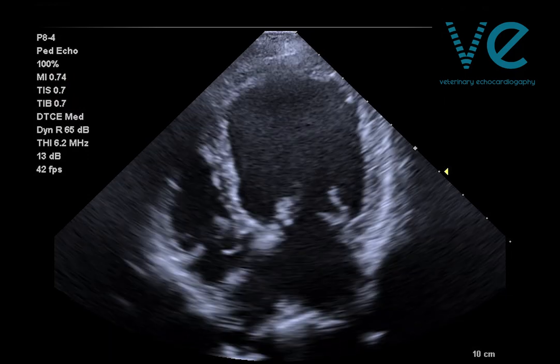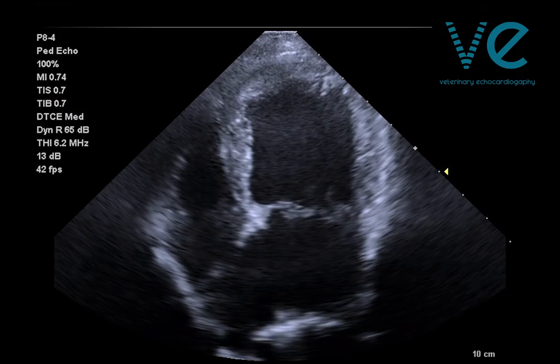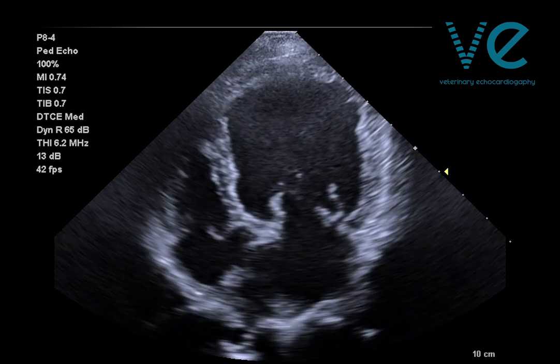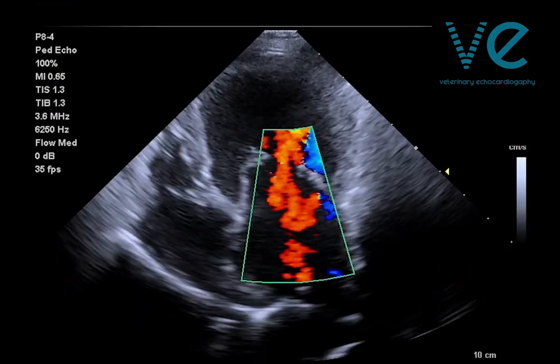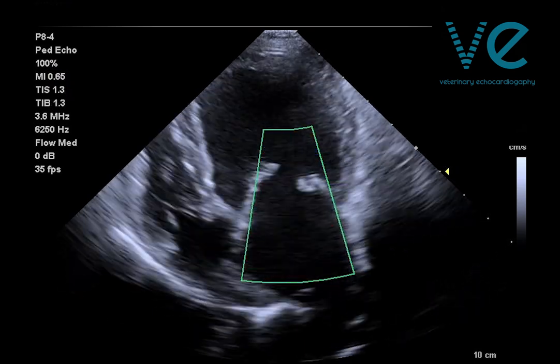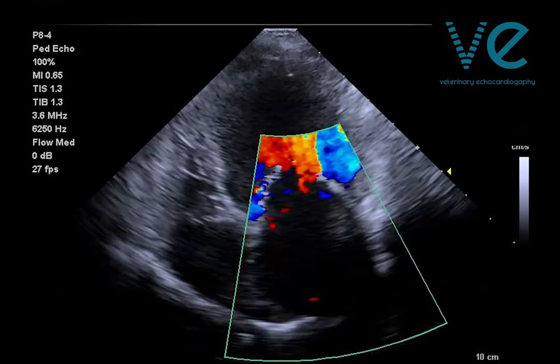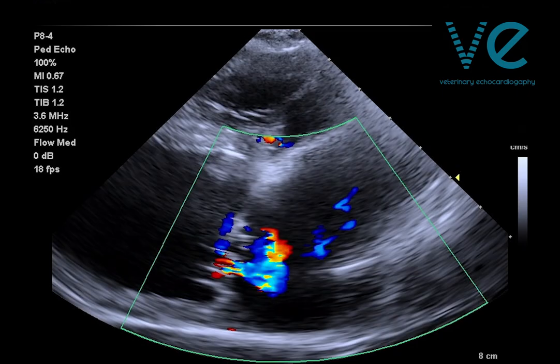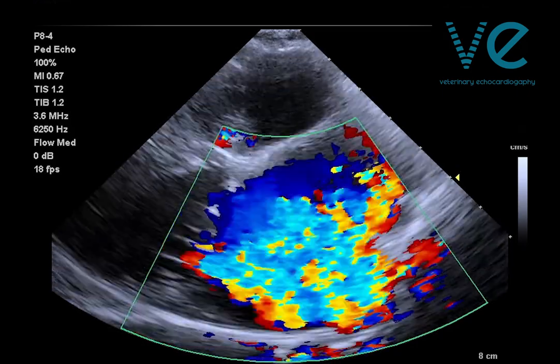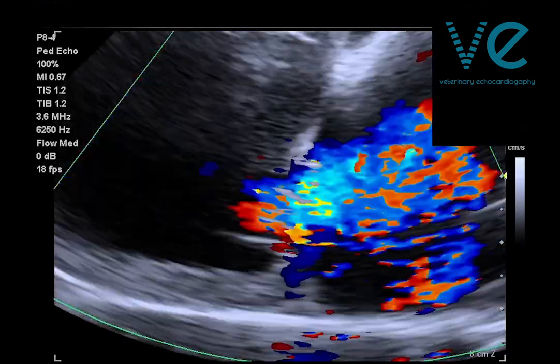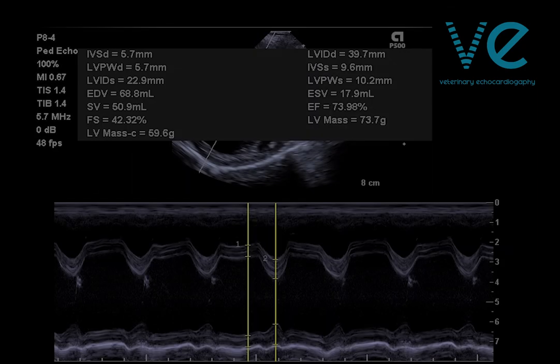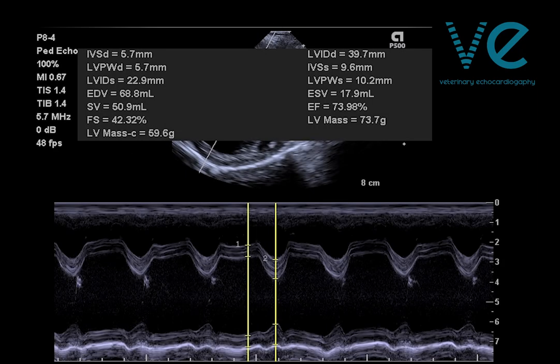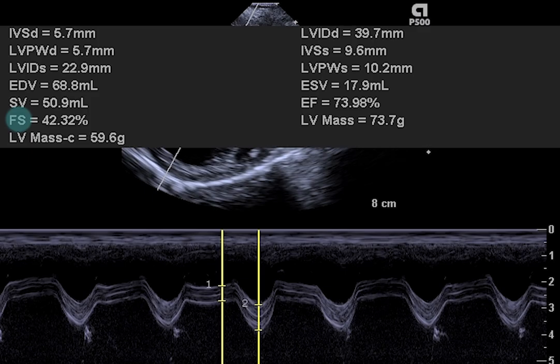What do you think colour Doppler will show? Unsurprisingly, severe mitral regurgitation. Taking our measurements the traditional way through the short axis with M-mode, my scanner is automatically giving me a fractional shortening of 42%.